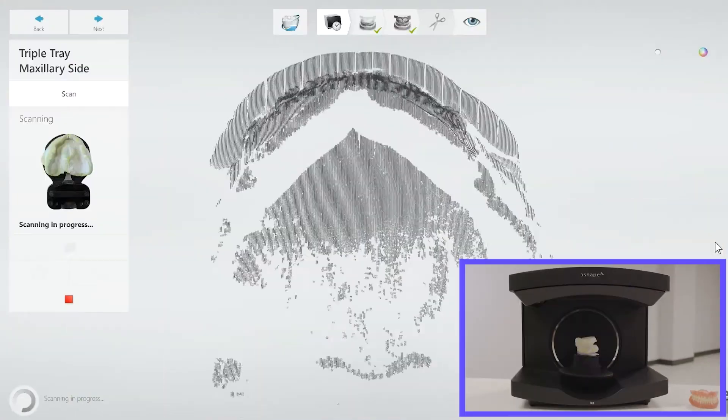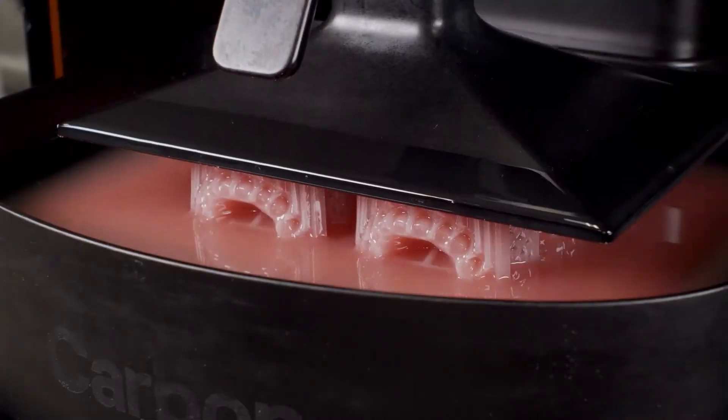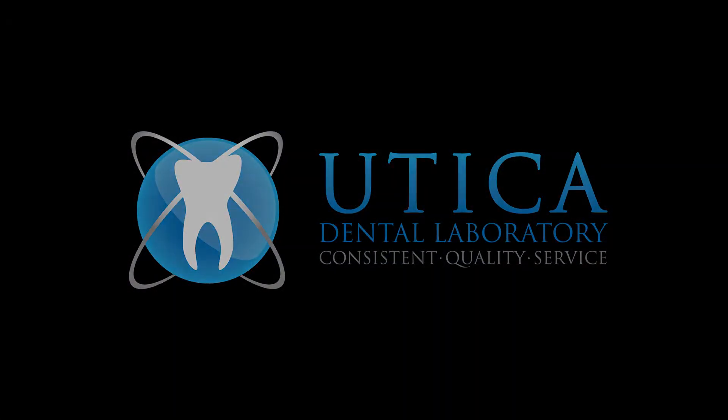Have you heard of 3D printed digital dentures? Let's talk about it. Today's video is going to focus on our 3D printed digital products. It's been over two years now since Utica Dental Lab has invested in a Carbon 3D printer, and the technology has completely revamped our workflow process for full dentures.